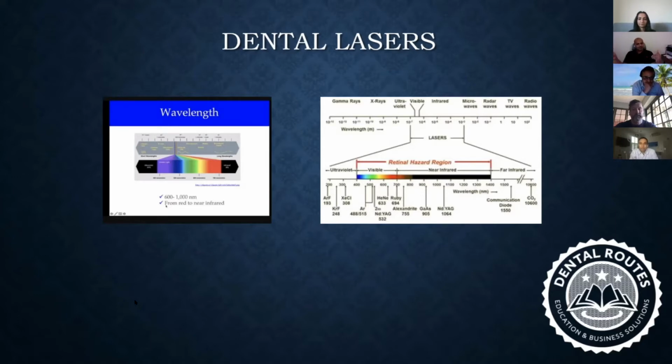During our discussion, we picked up this word, and I was trying to tell them that laser probably is a revolution in the dental evolution into the 21st century. With those kinds of explanation, what I want to first ponder upon is light itself, because it's something that was rusted in my head a long time ago.